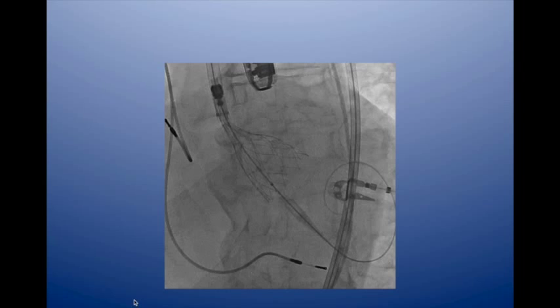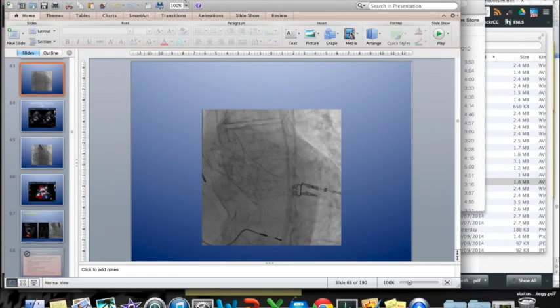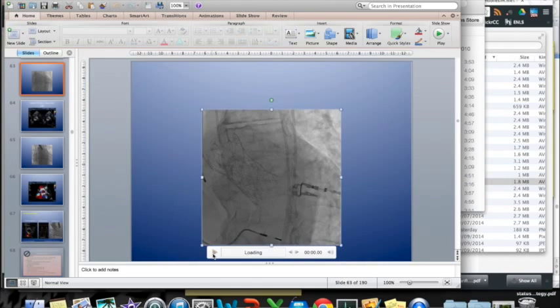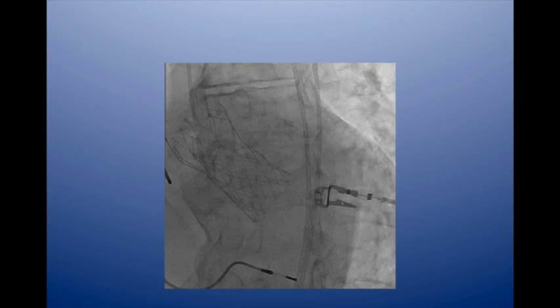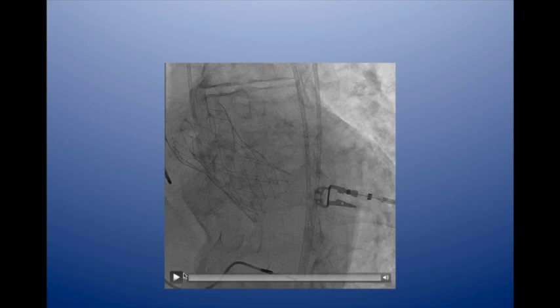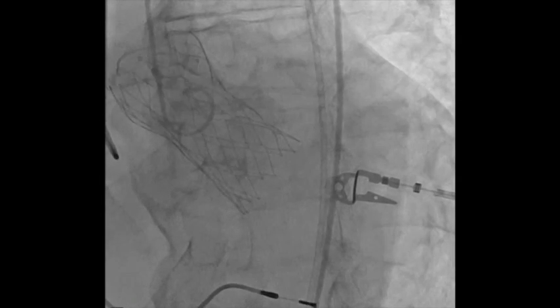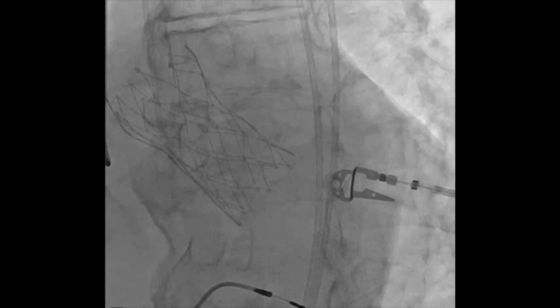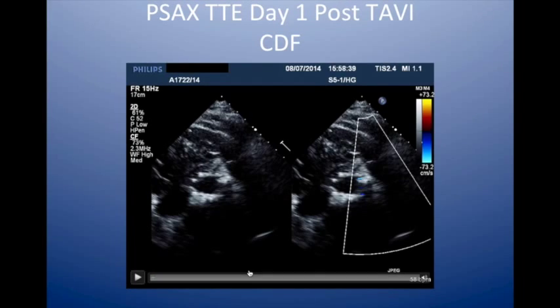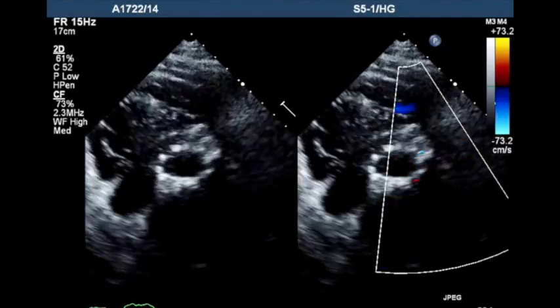This is the delivery of the valve. Basically, we turn a knob on the outside, the sheath comes back, and the valve opens as you can see. It's still attached just at the top. That's what it looks like at the end. Usually straight after that, the gradients are better, and there's very little aortic regurgitation if you've done a good job sizing the valve and deploying it at the right height.